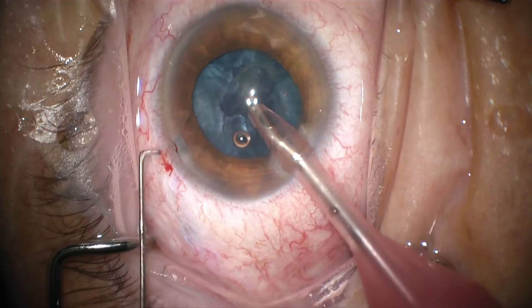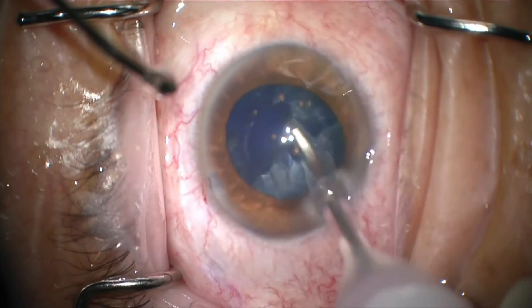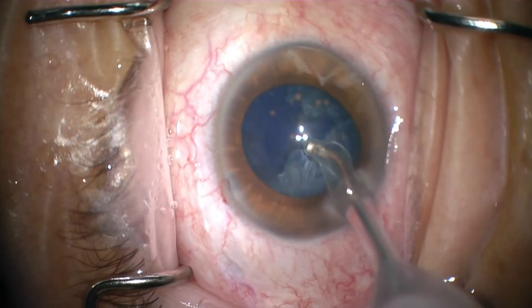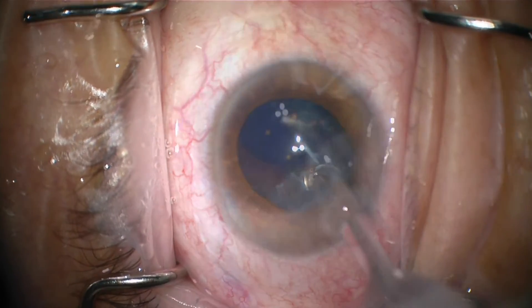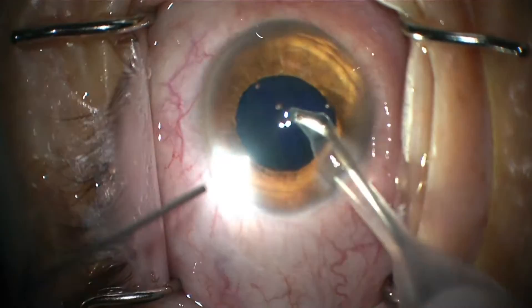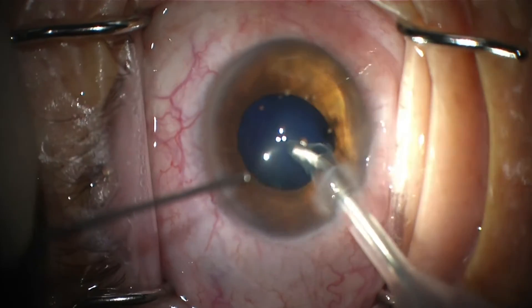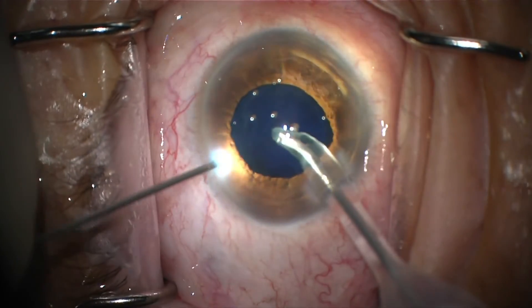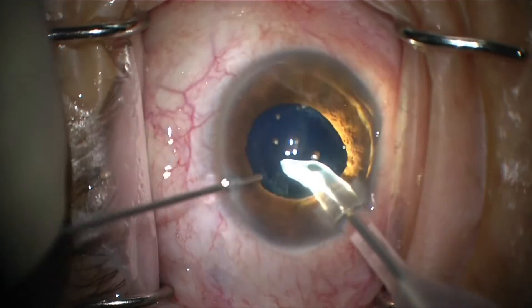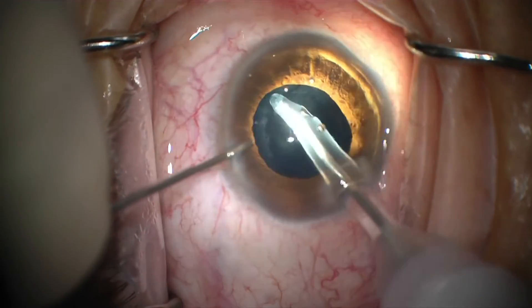When you have stained vitreous, it is next to impossible to get the red reflex back — you just can't see anything inside the eye. It's difficult to see cortex, difficult to see the anterior rhexis, difficult to tell if the implant goes in the capsular bag. A way to get around this, if you have access to it, is to use a light pipe inside the eye. We were lucky enough to be doing this case with a retina surgeon, so we had a light pipe on the field and it really came to our rescue.